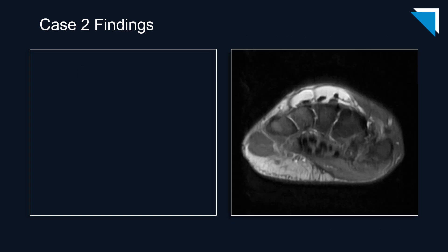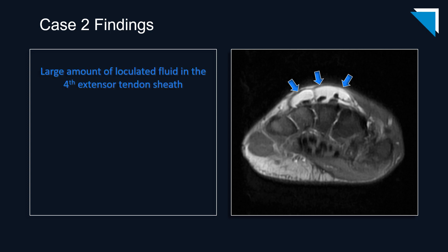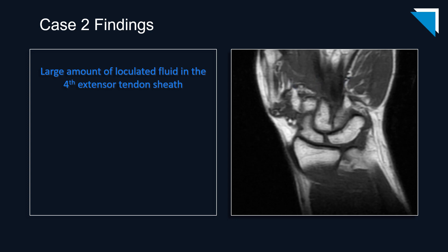Let's review our findings on this axial fluid-sensitive image. We have a large amount of loculated fluid in the fourth extensor tendon compartment, which likely accounts for the patient's palpable abnormality. This patient has quite a bit of significant degenerative change, particularly at the base of the thumb. So who could blame you for missing this incidental finding?